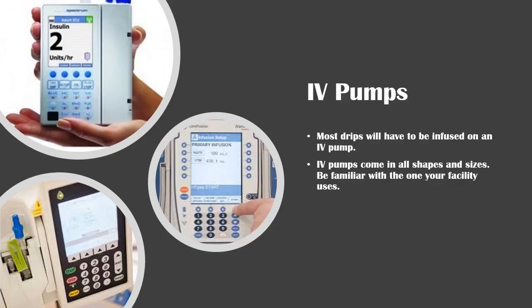I'm sure everybody remembers med math from paramedic class. We took a drip set and our stopwatch and we timed out the drips. Most drips that were taken out of the hospital are going to have to be on a pump because we really need that high degree of accuracy. If you remember from paramedic class, when we were timing stuff with our watch, we could get pretty close, but the really high degree of accuracy just wasn't there. So that's where the IV pump comes in, and the IV pump will ensure that accuracy.